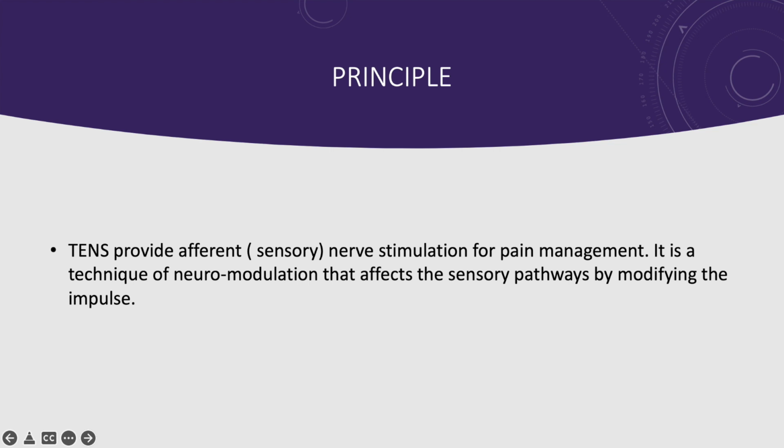Now we need to go on to the modes of TENS. There are different modes of TENS; 5 different modes are there in which we can apply TENS. This is an important question. It can be asked either as a short note question, what are the important modes of TENS, or one of the modes can be asked. So, different modes of application of TENS.